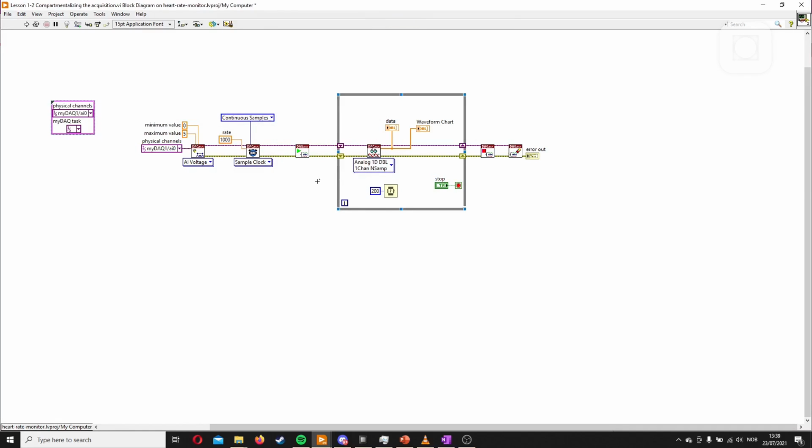We want to now separate these into 3 things. So we want the initiation, which is here, and then we want the read, which is here, and we want the close, which is here. We want them to be 3 separate units. And here we go. And we can start by deleting this one, because we will use the cluster as the input and the output.